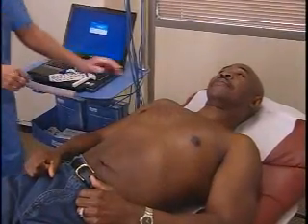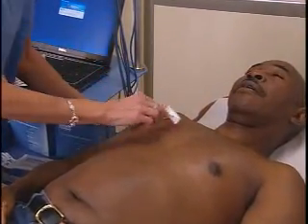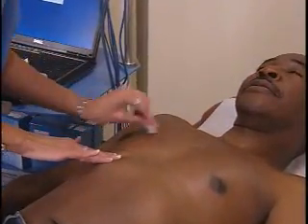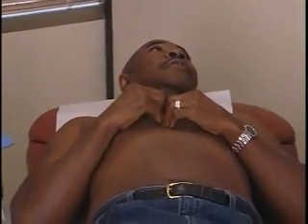It is very important that you explain to your patient that all preparation steps, including shaving the hair from the electrode sites, must be done. Proper preparation will assure optimal resistance between the skin and the electrode. Remember the following points when preparing a patient for an ECG.